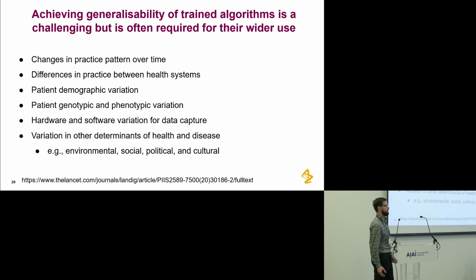But the problem is, I wouldn't say problem, it's that our world is dynamic, so practice changes, it improves, technology changes. For example, these H&E images are scanned with a scanner. Scanners change, there are different vendors, and the tissue is prepared by humans. Humans prepare it differently. It's stained already by robots, but different types of robots.